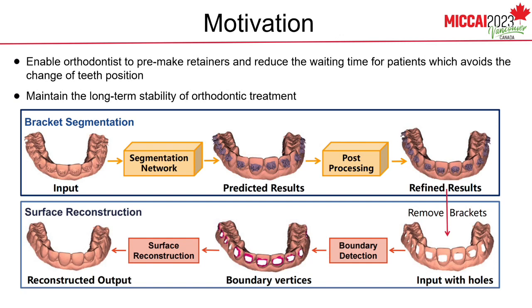However, it takes approximately 20 minutes for an orthodontist to precisely delineate brackets on a digital model. Additionally, the bracket segmentation requires a very high level of precision, otherwise it will affect the reconstruction step. An efficient and precise bracket segmentation method is crucial in orthodontic treatment.